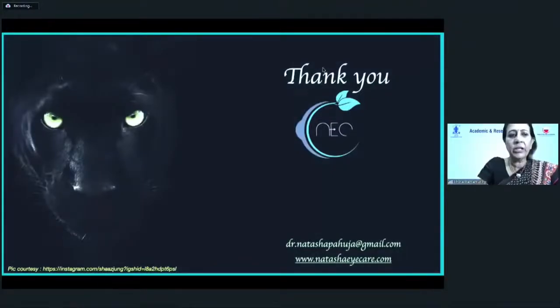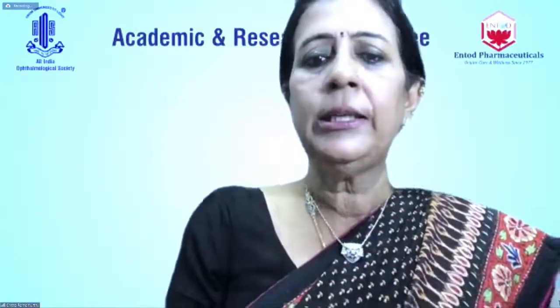Thanks a lot, Natasha. That was very useful information which you gave us. But with the 458 cornea, of course, we do not have Schwind. We would have confidently gone ahead and done a topo-guided regularization because we still have enough tissue to remove. Now, supposing you had 458 corneal thickness, and supposing you are stuck with a 435 or a 440 and you don't have the facility to do TREC and you don't have access to Schwind.